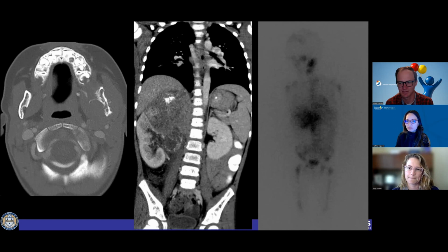Yeah, because I wonder if you were able to see anything on the scout images? Oh, on the localizer images? I think that they cut off okay at the pelvis. It was just diffuse marrow abnormalities. Yeah, it wasn't a long delay. It was just a couple days.